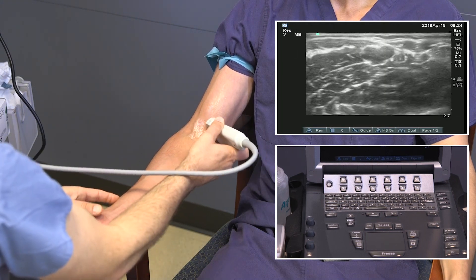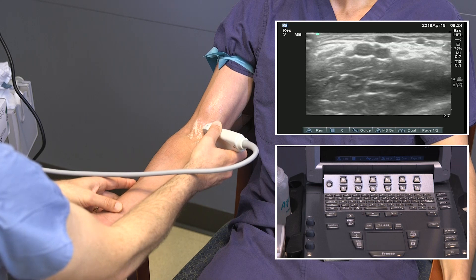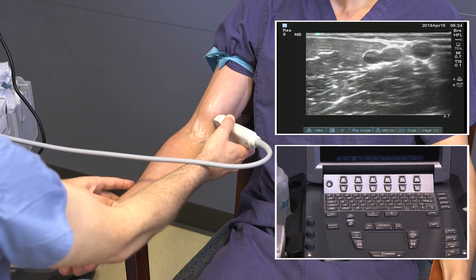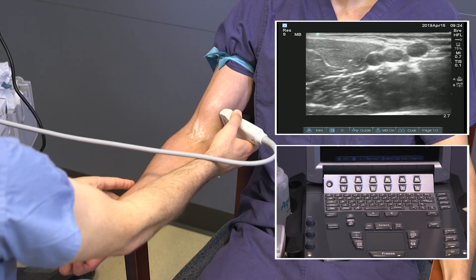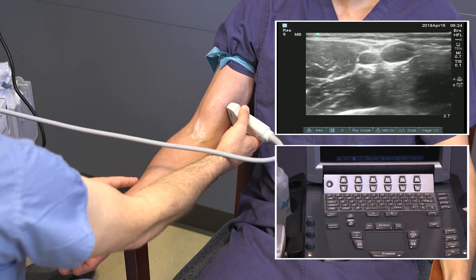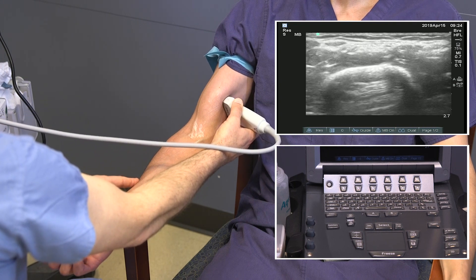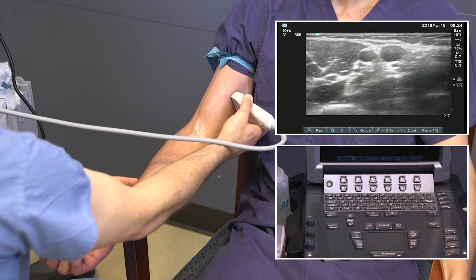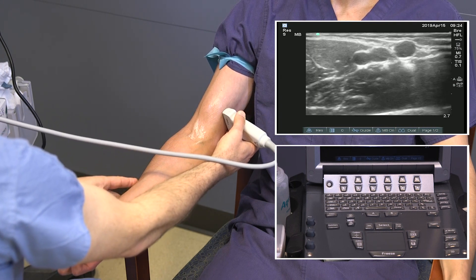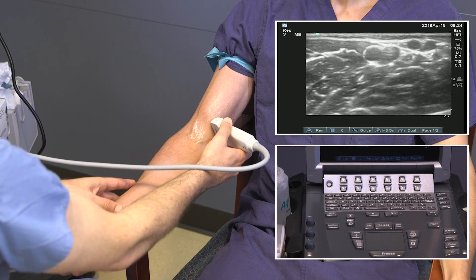Now we're going to think about accessing the artery and vein. We see that the basilic vein joins the brachial system very early, low down in the arm. After that, there's a single dominant brachial vein going up the arm.